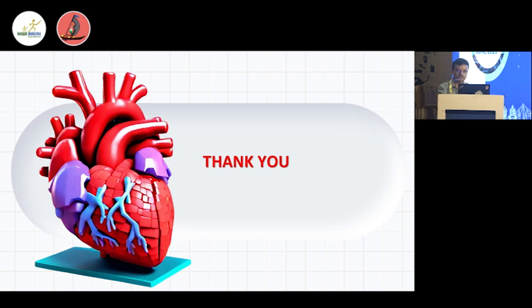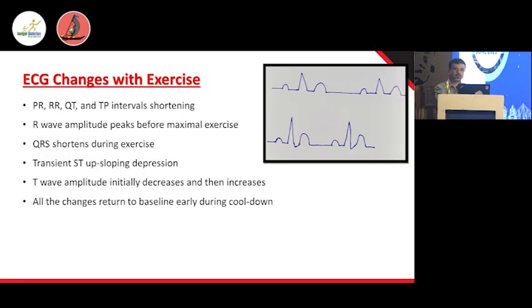you should correlate accordingly. Left main disease: multiple leads with ST segment depression along with ST segment elevation in aVR, and this elevation in aVR will be more than in V1, which goes more in favor of left main disease. And then subsequently you can go for the various biomarker studies like troponin T, D-dimer, chest X-ray and echo to pick up the actual cause.